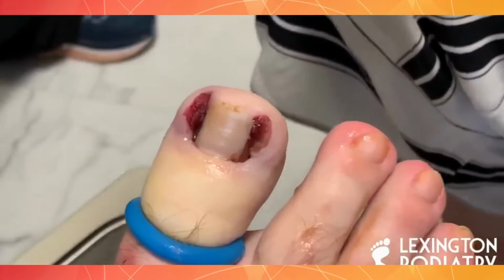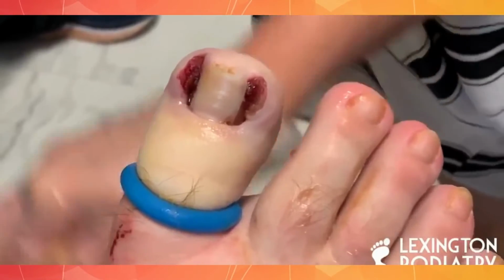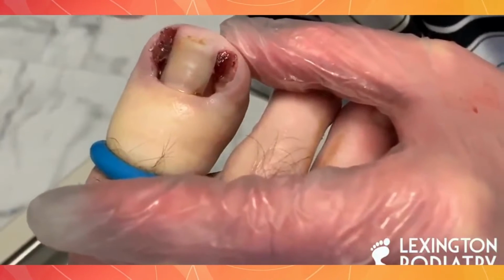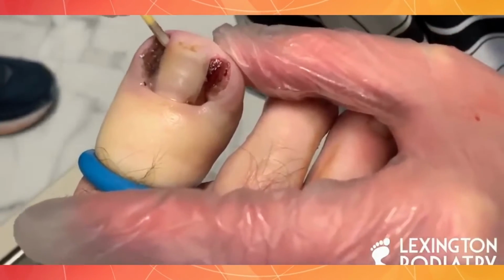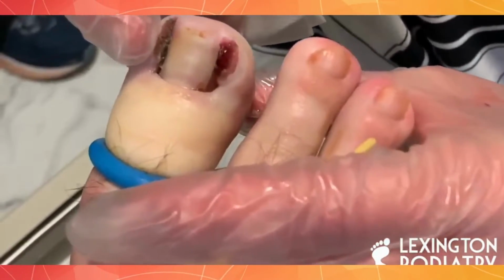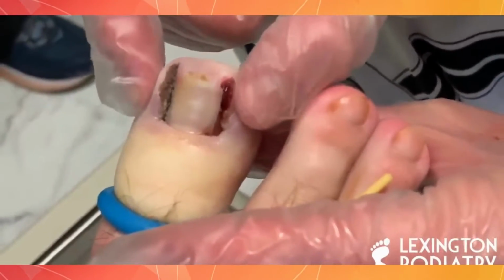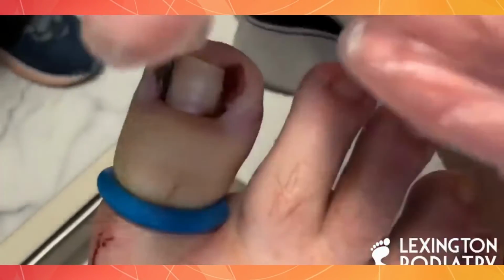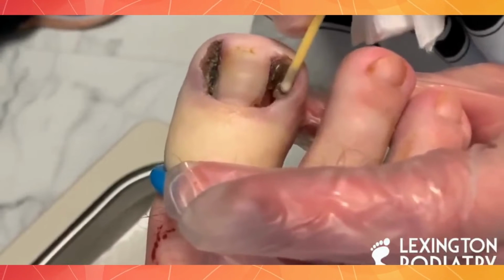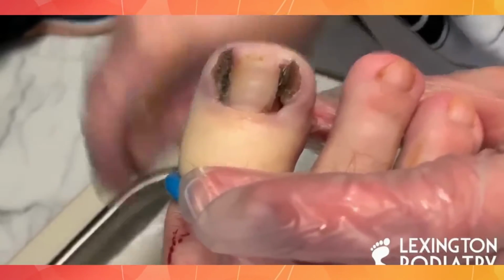All right, let's get that silver nitrate. The first one. Gauze, please. Thank you. Okay, just roll that on there. Again, it's going to cauterize it. And the next time I see him, the skin's actually going to retract back here. So it's going to pull in, and this will also debulk over time. Everything wants to come back to normal. If I were to take the tourniquet off right now, this guy would really be bleeding.